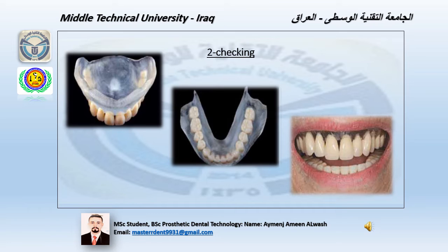We will milling the lower complete denture and bonded the teeth to the denture base. After that we send to the clinic for check inside the patient mouth.